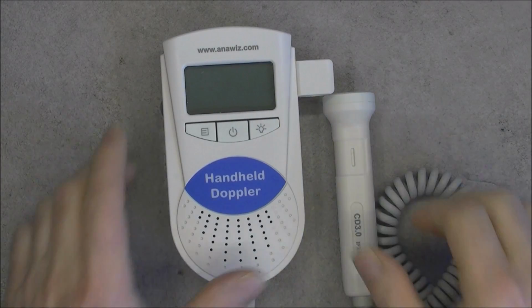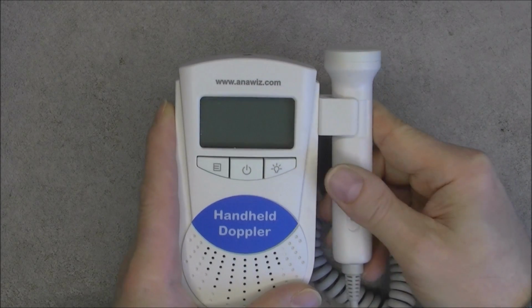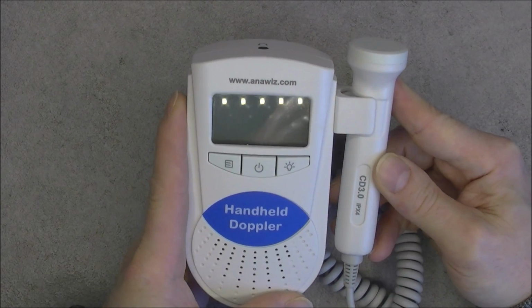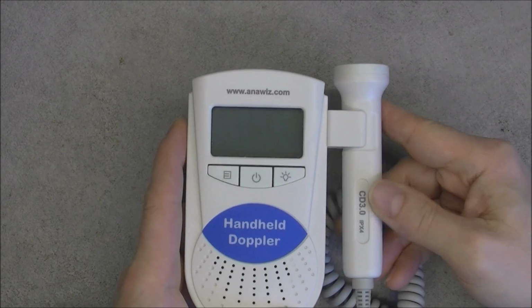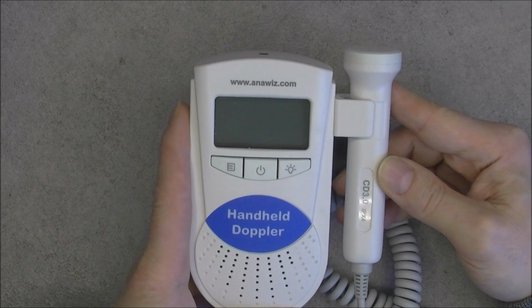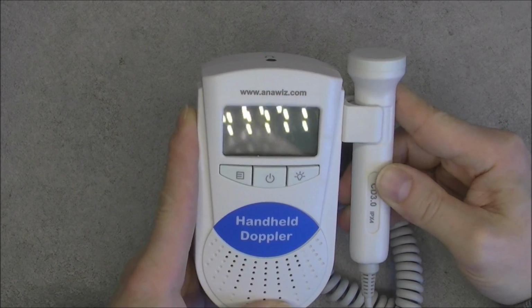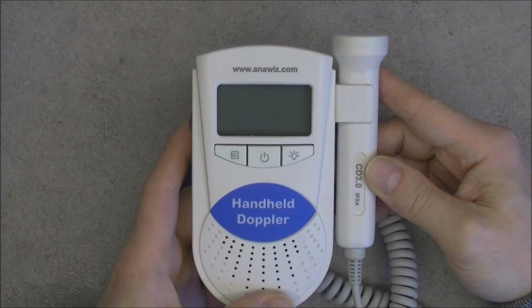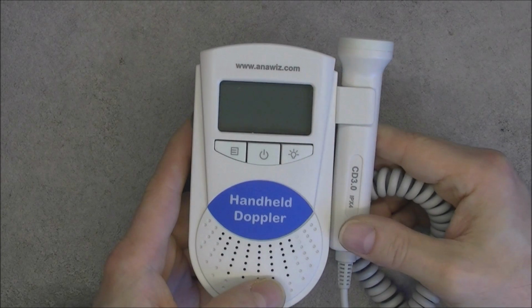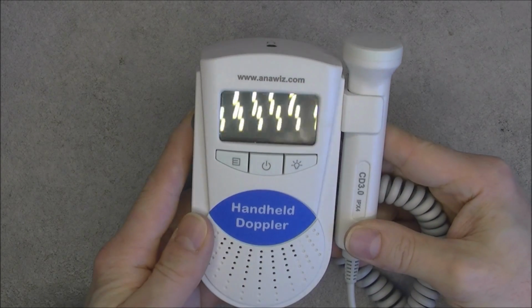Hi, for today's teardown, the Anapulse 500 handheld doppler. It is a device for measuring the heart rate of a fetus inside the mother and also listening to it. It is not a very expensive item. It can be found at around 70 euros new. I got this one for €1 because it seems it is not working properly.